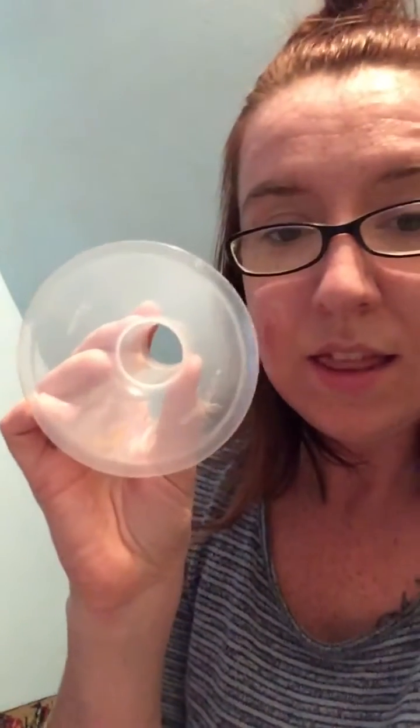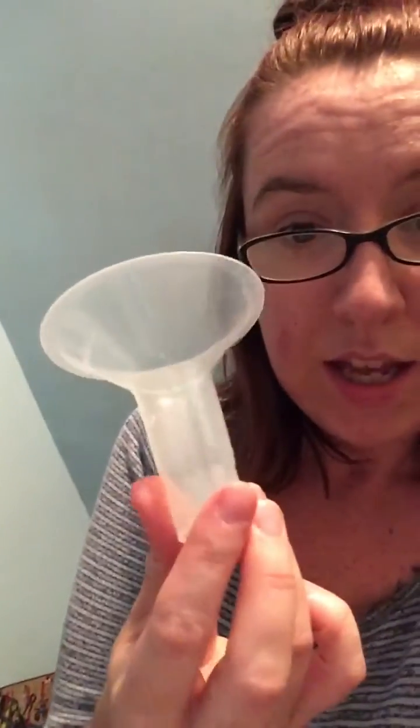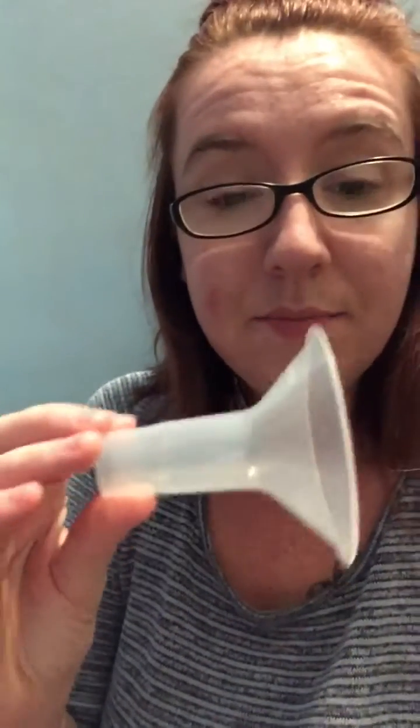So, let's talk parts and pieces. This is piece number one. This is your breast shield, and they come in different sizes. This size right here is the 27mm flange, or the large. And this one is the 24mm. This is the size that the Medela breast pumps automatically come with.